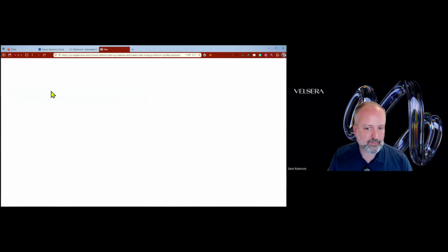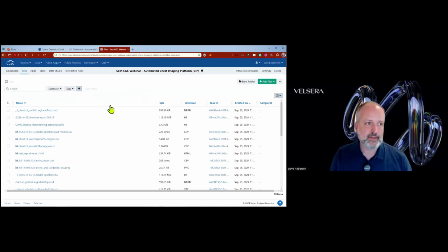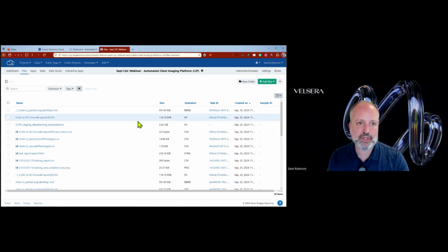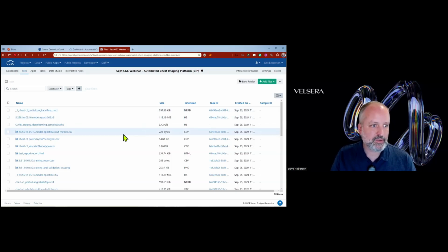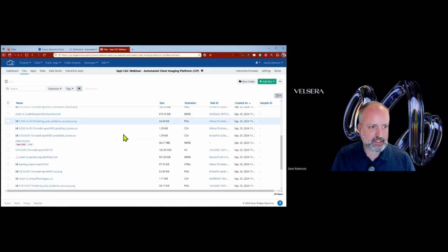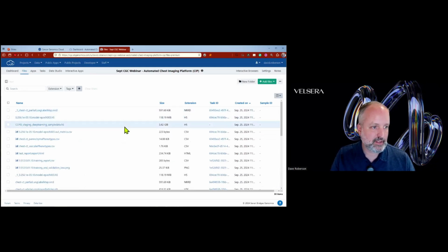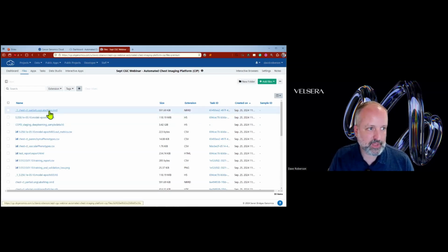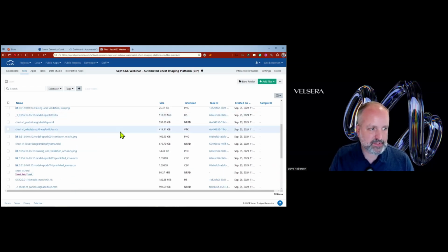So we have files. The files tab, everything is pretty much files based. So these files are actually links to, in this case, the Amazon bucket, which has these as object-based storage. So this doesn't contain any of the DICOM images. It starts out with everything as an NRRD file, and these are the chest CT labeled images. But it also has some phenotypes and some reports.